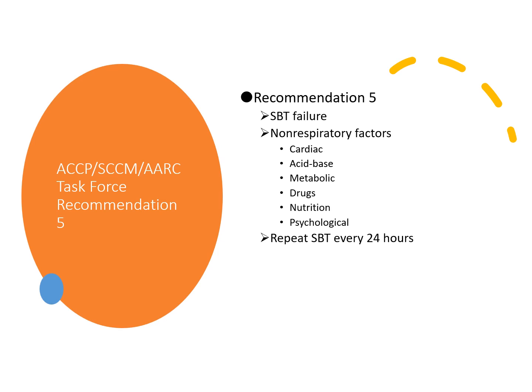For patients that fail spontaneous breathing trials, that's where we have to look at what happened, why did they fail, what is the cause, right? Before we consider this again, when the reversible causes of failure have been corrected, and they still meet criteria for discontinuing ventilation, then we should do another spontaneous breathing trial every 24 hours just to make sure. It's important to avoid pushing patients to the point of exhaustion during the wean. So you can't just let them go all day, right?